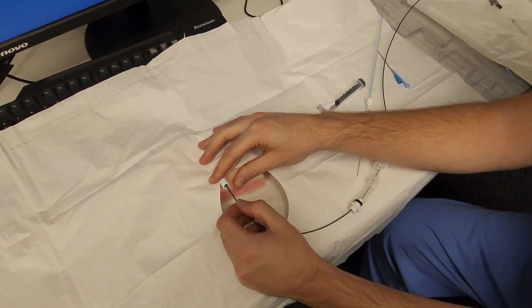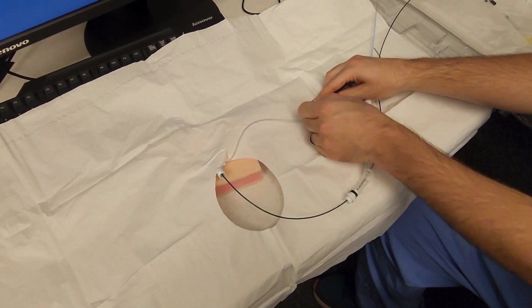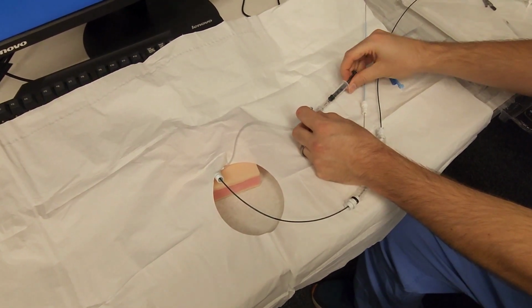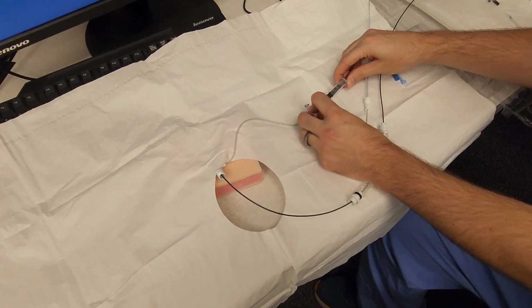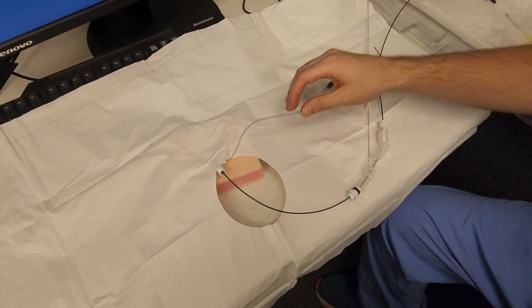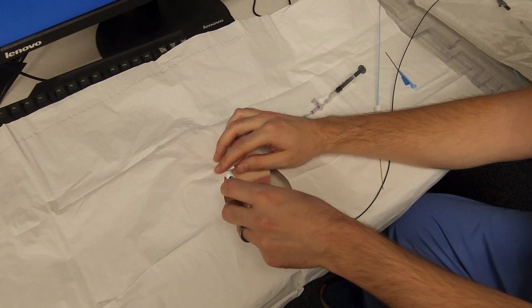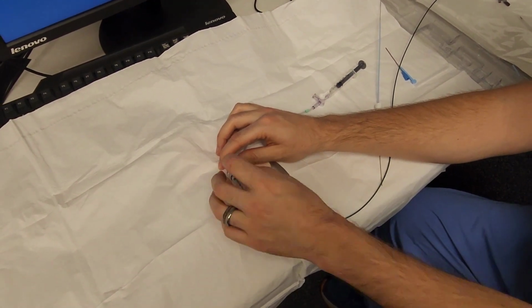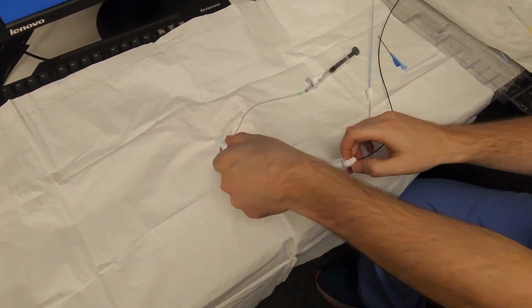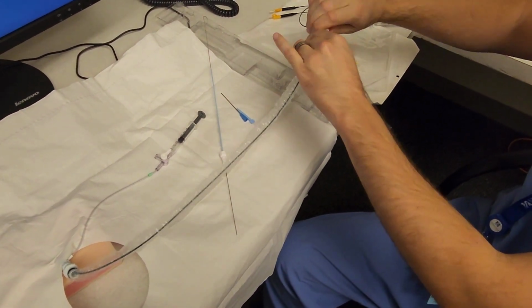Once you're in a spot where you have capture, you can deflate the balloon. Lock the stopcock, and then you're going to lock your wire in place by screwing the distal end tight here, and then extend your sheath along your wire and screw it on tight here.